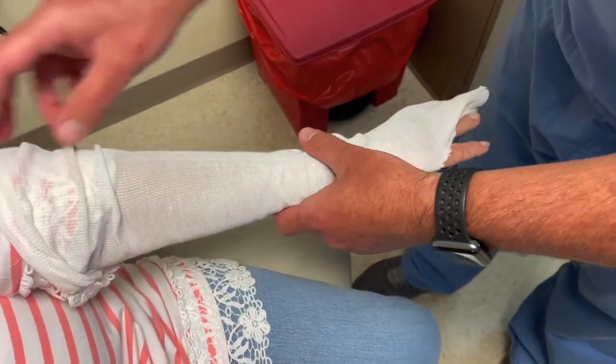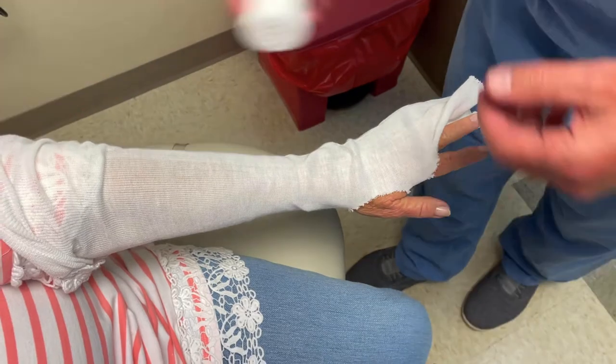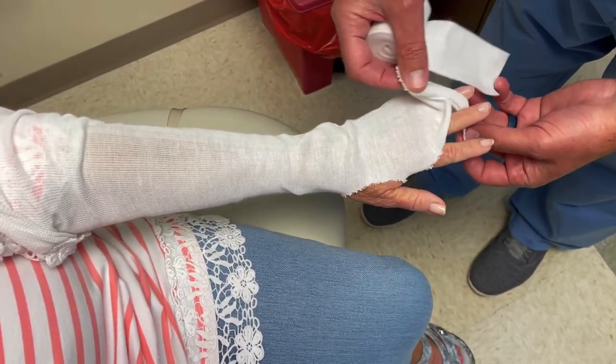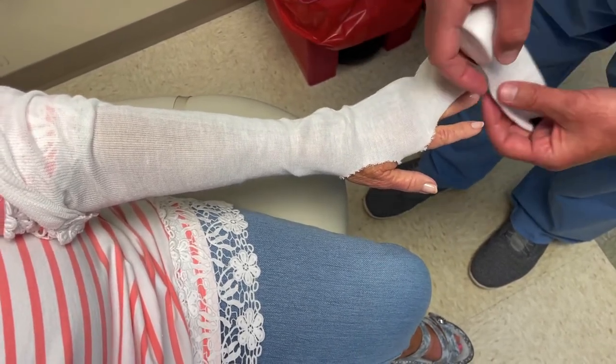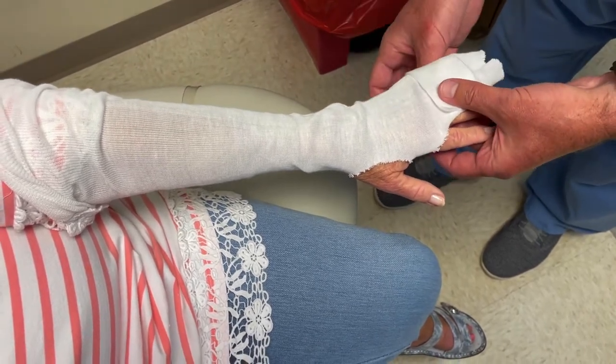Get all your wrinkles out — that looks pretty good — and we're just gonna start wrapping up here. Because we're not gonna be in this for a long time, I'm not too worried about the skin between the fingers. Sometimes you have to pad in there. If she was gonna be casted we'd be putting stuff inside there, but for this purpose we can just start wrapping.